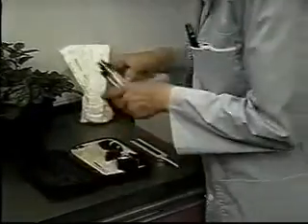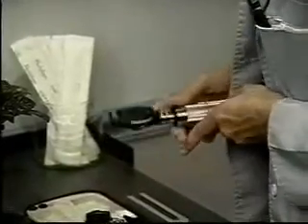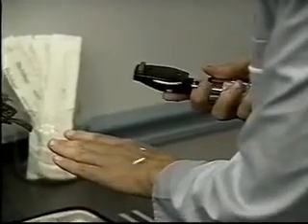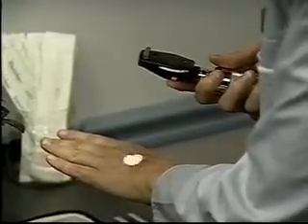When you're ready to examine the fundus, switch on the ophthalmoscope light and adjust it to the large round beam of white light. Also make sure the light is bright enough. Set the ophthalmoscope to 0 diopters.